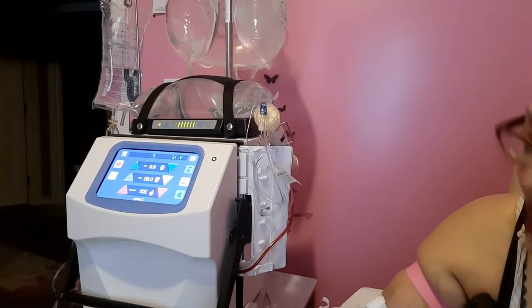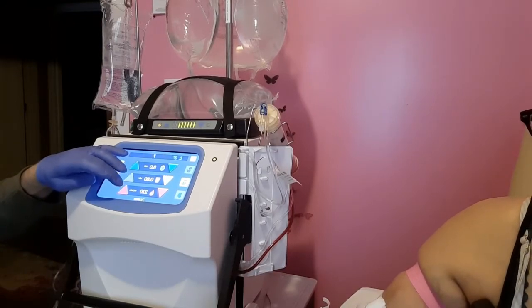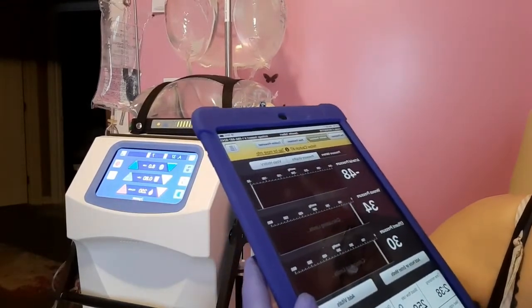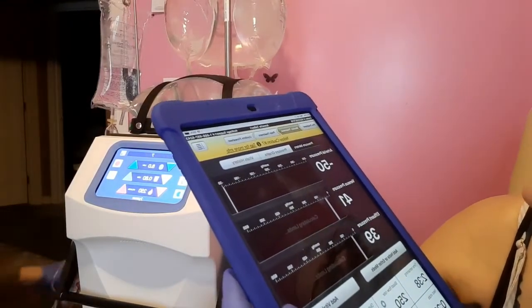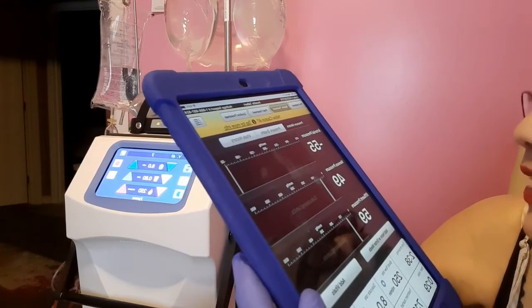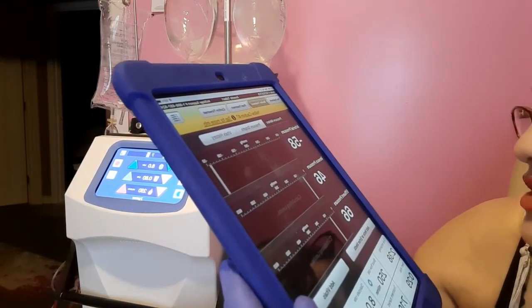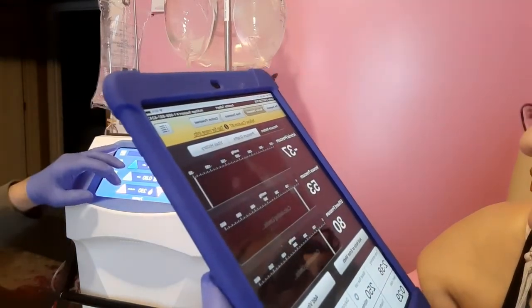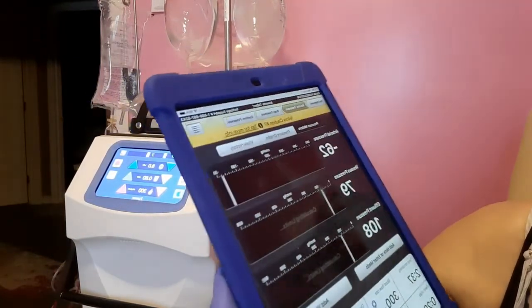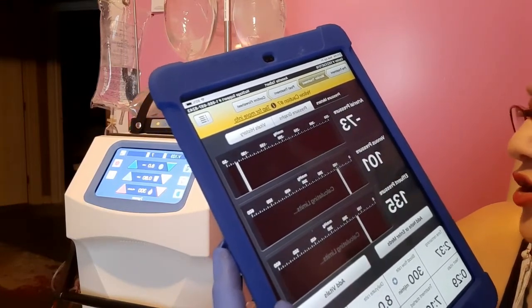You need to go up to 250. Alright, he's going up to 250. Pressure looks good. The pressure should always be 50% of whatever the flow is. Blood pressure flow. So go up to 300. He's at 300. Still looking good. Still under 50%. Go to 350.